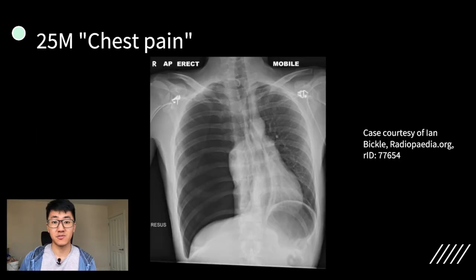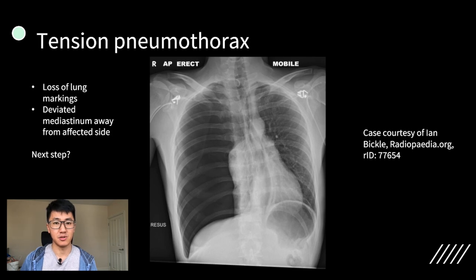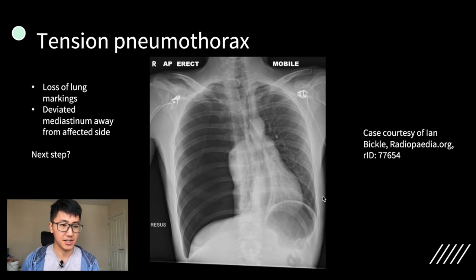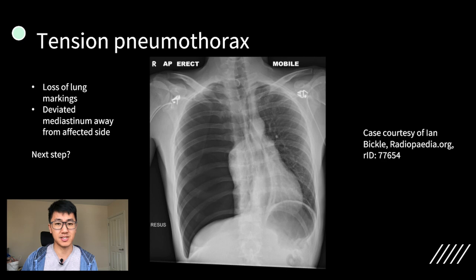On to the next case. Pause the video now and have a look and see what you think. So this is an example of a right-sided tension pneumothorax. That's because you've lost the lung markings in the entire right hemithorax. And what would make it a tension pneumothorax is that the mediastinum is deviated away from the affected side. When you're seeing this as a doctor, you have to think about the next step because tension pneumothorax is a medical emergency and you need to think about urgent treatment.